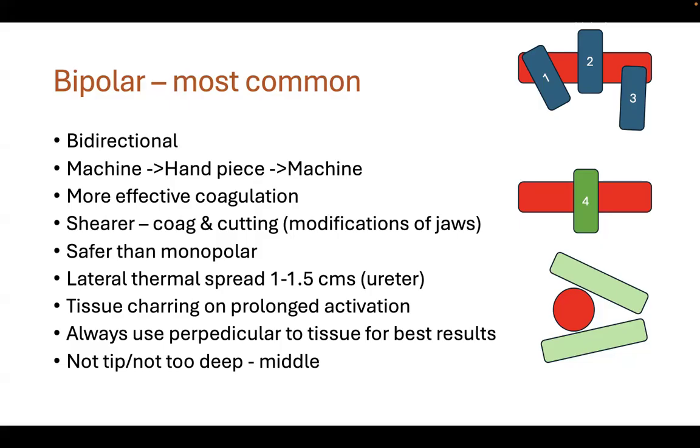of the ureter protects it. So many people, after cutting the uterine, directly go on to cutting the vault because the vault will be easily visible there. Just by putting a vaginal tube, the vault can be delineated. But make sure that you cut the cardinal ligament and also the uterosacral and lateralize it so that the ureter gets lateralized at least 1 to 1.5 centimeters, and this safeguards the ureter.